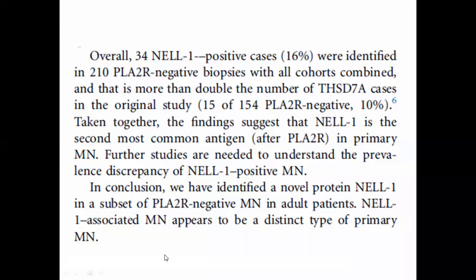So you need to remember that if we are doing complete immunofluorescence, there are still some centers who don't do kappa lambda immunofluorescence, and they say that kappa lambda will be done only if there is an elderly patient. Ideally, you should be doing complete immunofluorescence, all the antibodies related to the immunofluorescence panel. You should have all the immunoglobulins and complement. That means IgG, IgA, IgM, and complement C3, C1q, along with light chains. Okay, and IgG subclasses, PLA2R, thrombospondin if you are doing.